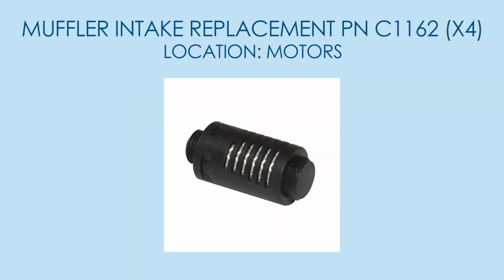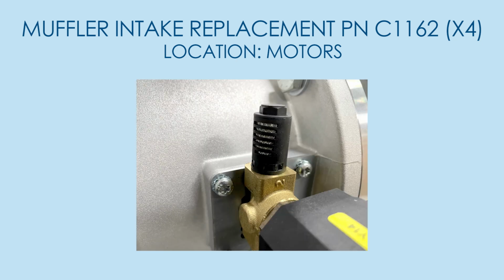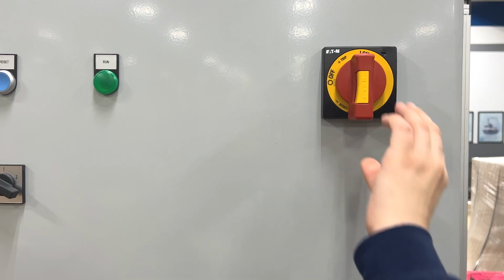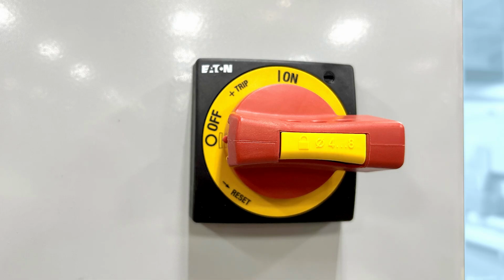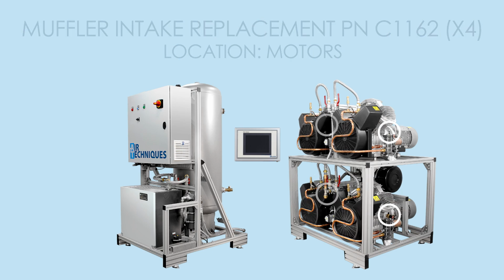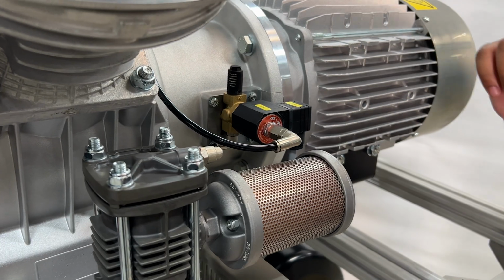In this video, we're going to be covering muffler intake replacement, part number C1162 for clinical compressor systems. To begin, power down the system and ensure all equipment is safely shut off. Locate the muffler intake on each aggregate that requires replacement.